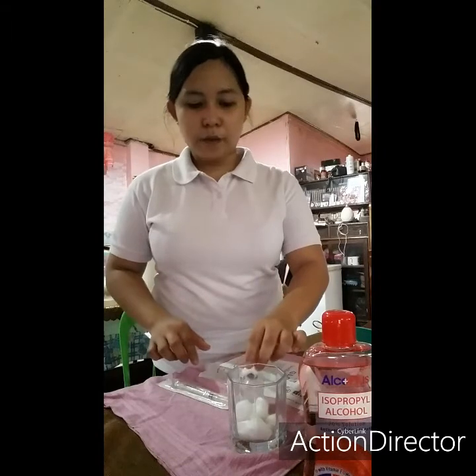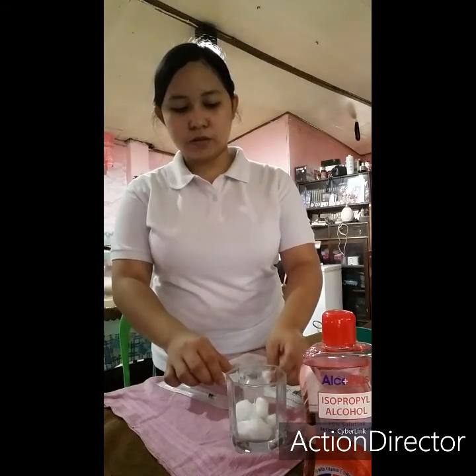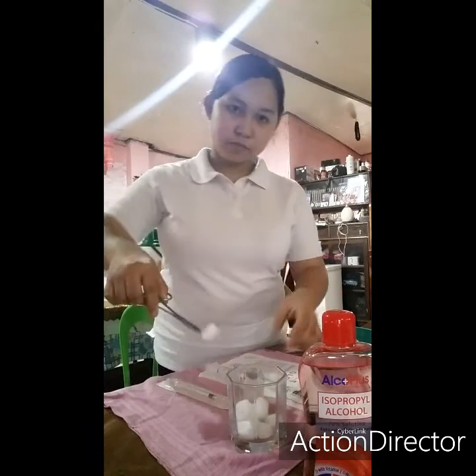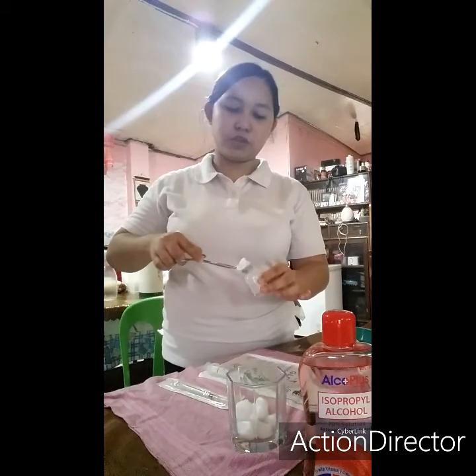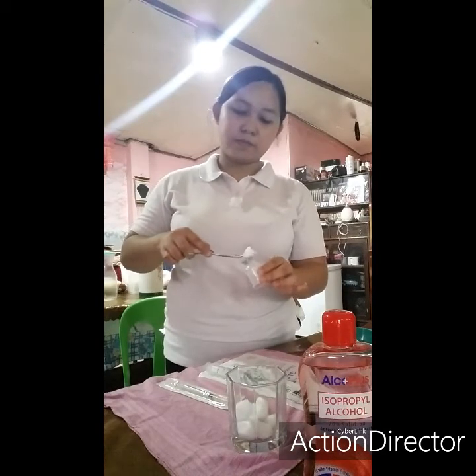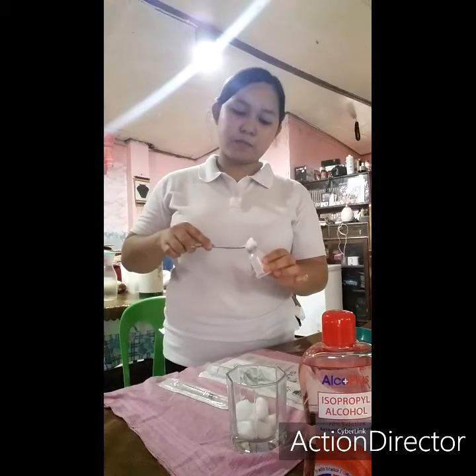And now, open our medication vial. Then, cleanse it with alcohol and antiseptic solution for 10 to 15 seconds. Then, keep it dry. Discard.